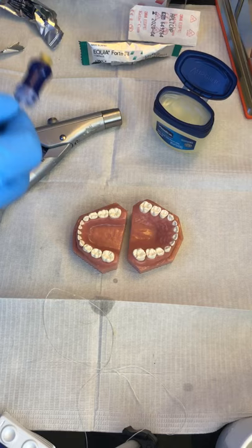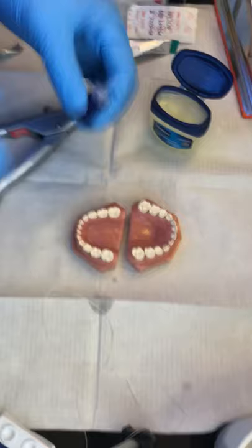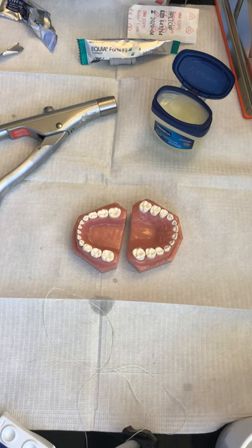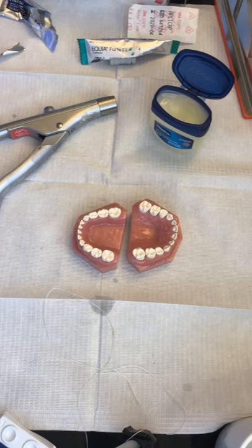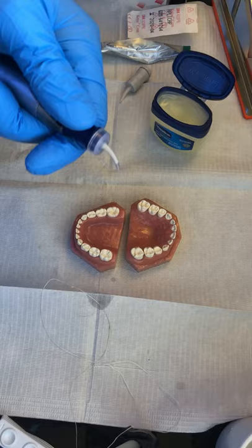It still has a plunger. You need to break the plunger by depressing it hard — you hear that squeak? That was it. Now I'm going to triturate it in my triturator, amalgamator, what have you. As Dr. Robert Christensen says, you're going to manhandle that thing to get it in there. That low frequency hum is mixing for 10 seconds, and from there we have 35 seconds to put it onto the teeth. Three clicks and it's ready to go.